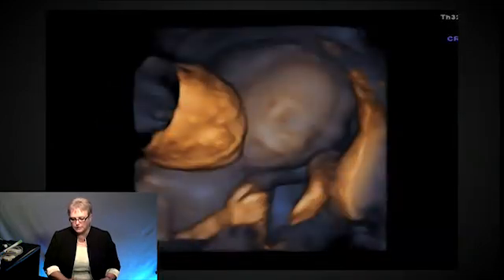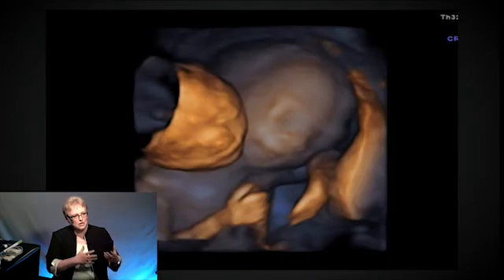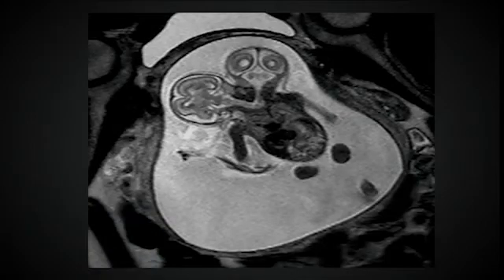And these are the babies. And what was interesting, there was more flow on the left side than on the right, so the left side of the body was a little bit larger, was measuring on target, and the right side of the body was measuring a little bit smaller. So this is just the 3D. So you can see the one spine, and you can see how it divides off into the two calvarii. And then the MRI. You can see how it splits off right here.